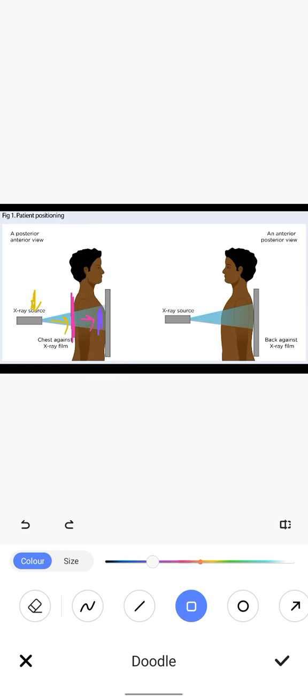Now, in the second image, this is the X-ray source, and the X-rays are emitting from the X-ray source, interacting with the anterior side of the body, then getting into the body and coming out of the posterior side of the body, or the back of the body, and striking the detector. Now, what's the difference between these two images? Why am I explaining these things?